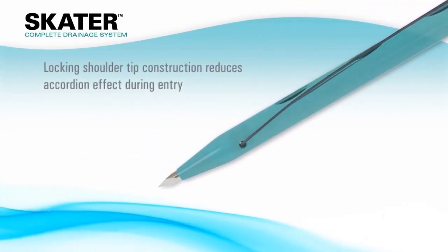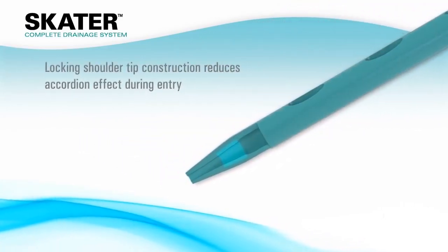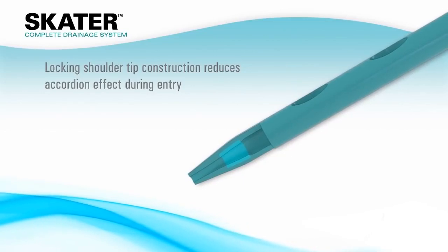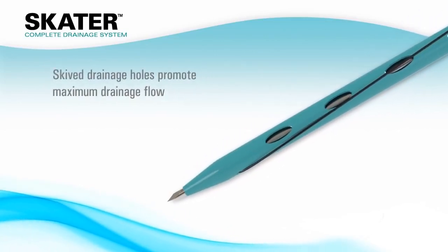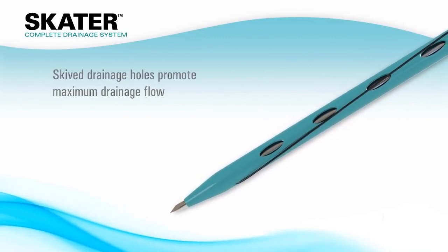First, the locking shoulder tip construction reduces the potential accordion effect during entry while allowing for large skived drainage holes to promote maximum flow.